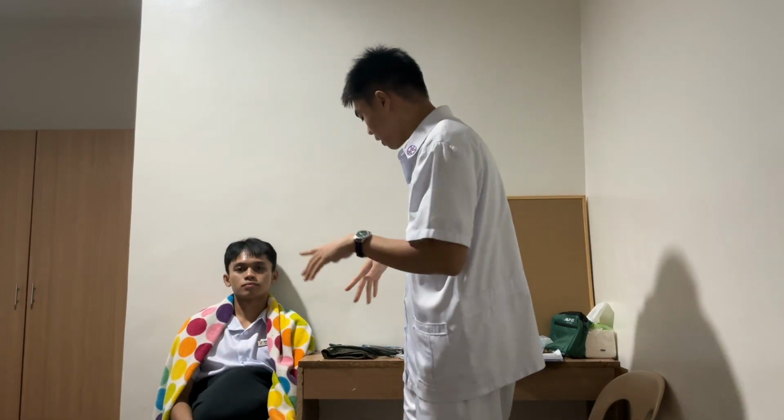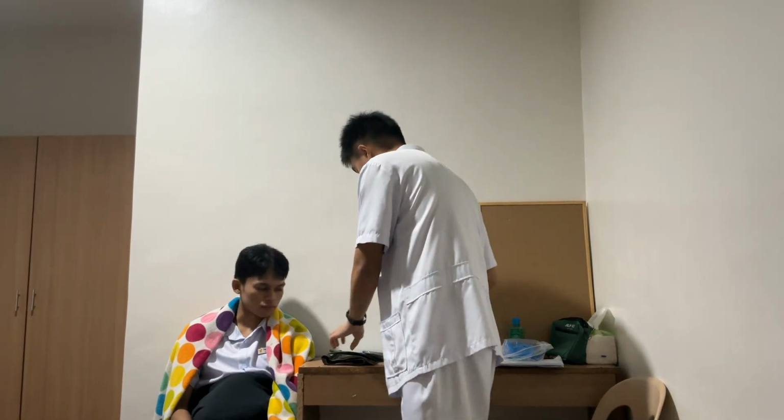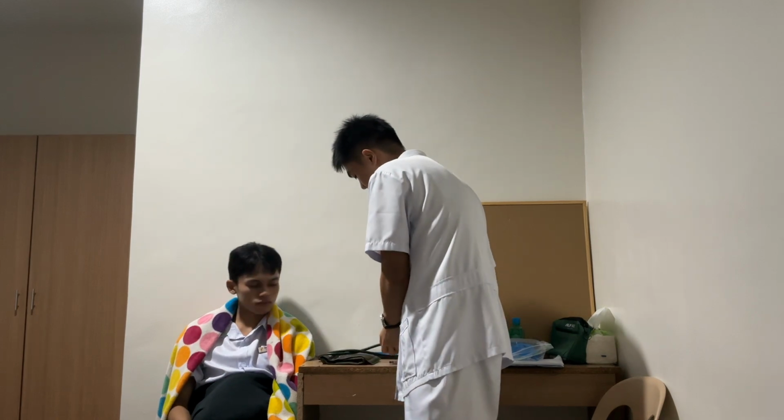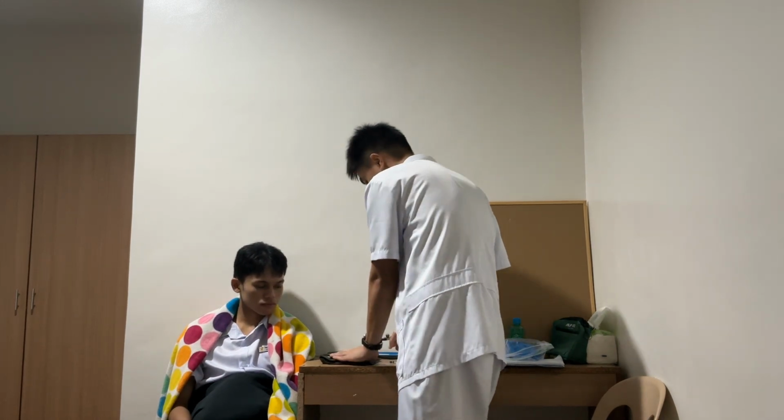So I'm going to be checking the cuff size. So assuming that the cuff size is perfect for the mother, the patient, the client, then it is what I will be using. So I will then be checking if it is correct. If there is any leakage, when I inflate it and deflate it, is it functioning well?